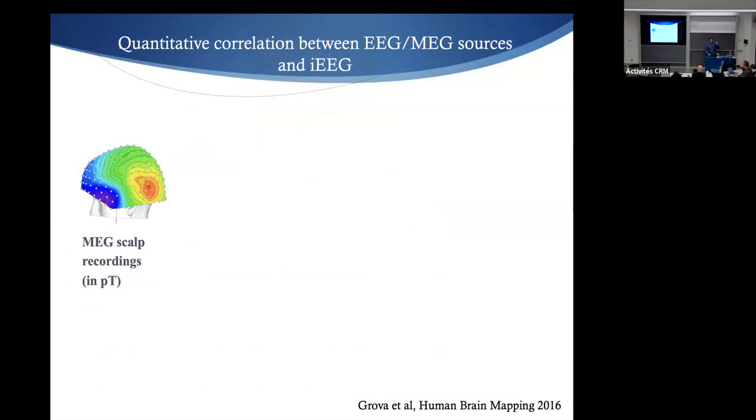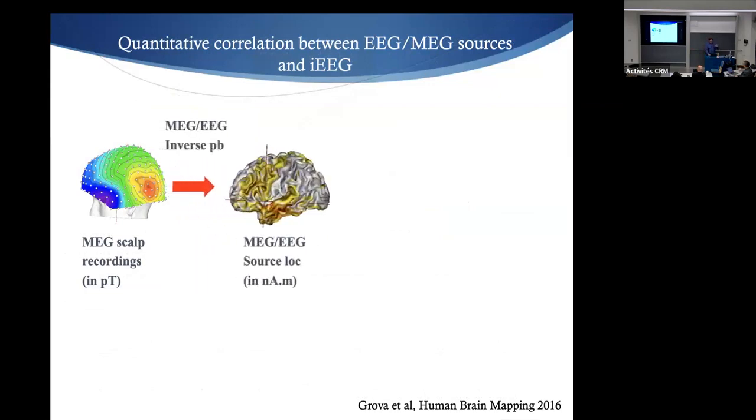We first applied our favorite MEM method to have 3D reconstruction along the cortex, and then to know what information from that, because SEEG is a very nice gold standard, but only where you have intracranial EEG electrodes. We cannot say anything where we don't have electrodes. So the idea was to project our finding into the SEEG space.